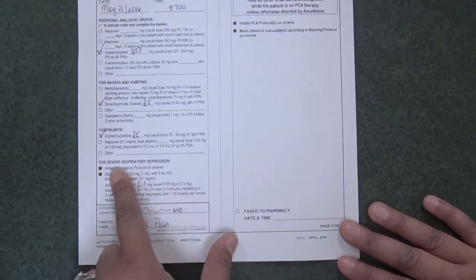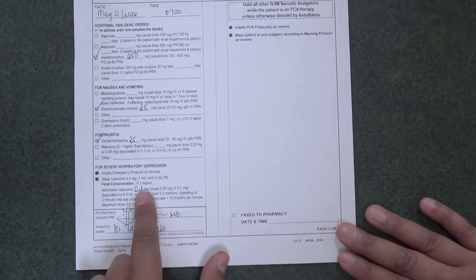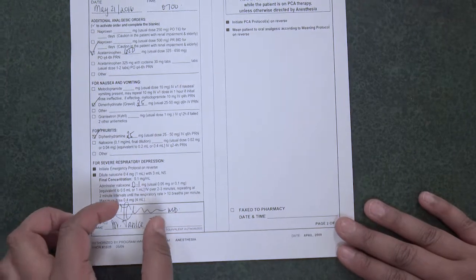In addition, you'll always see, for severe respiratory depression, an order for Narcan. This will all be on a separate MAR sheet.